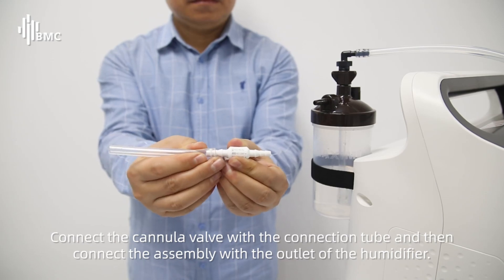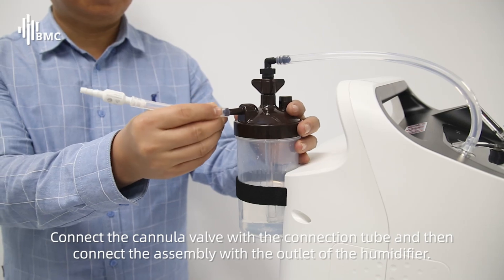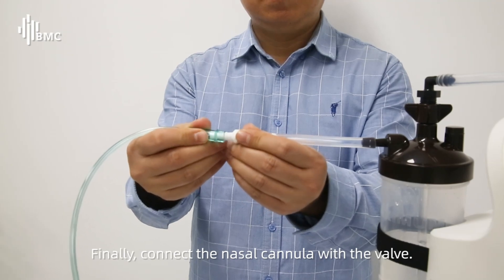Connect the cannula valve with the connection tube and then connect the assembly with the outlet of the humidifier. Finally, connect the nasal cannula with the valve.